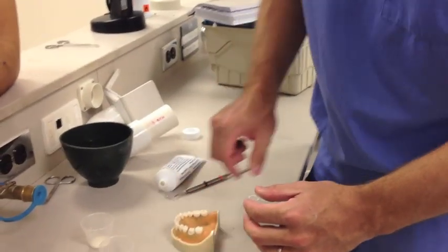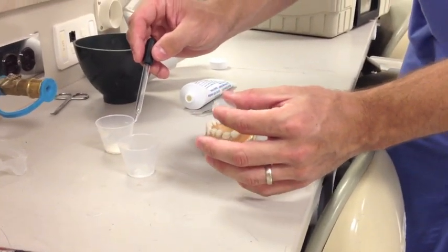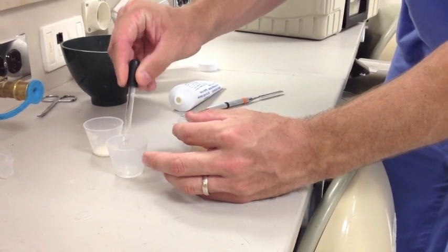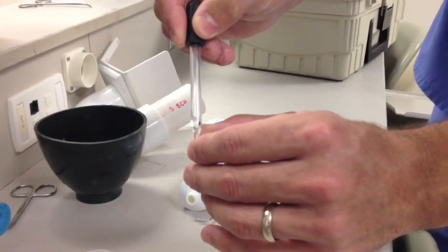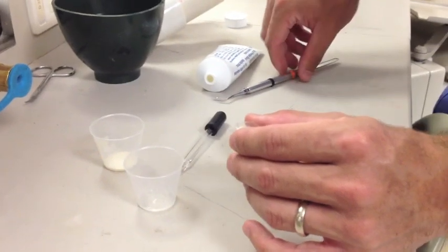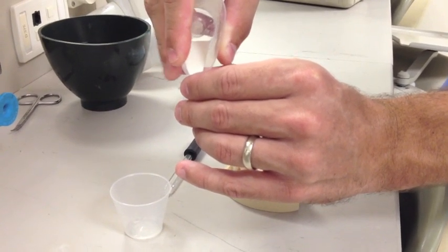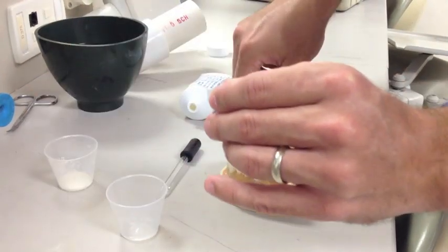We've lubed up the typodont, and now we're going to be mixing the acrylic in the stent. This is a little different than they show you in class. It's a lot easier to do it right in the stent instead of mixing it separately and trying to transfer it — that just gets confusing. We did not put Vaseline on the stent; some people say to, but I really don't like that method. We're just going to put a little drop of monomer in and then tap a little bit of acrylic in, mixing at each stage.